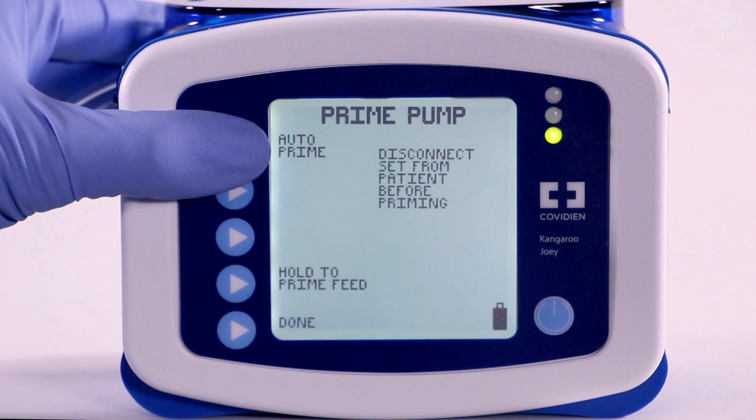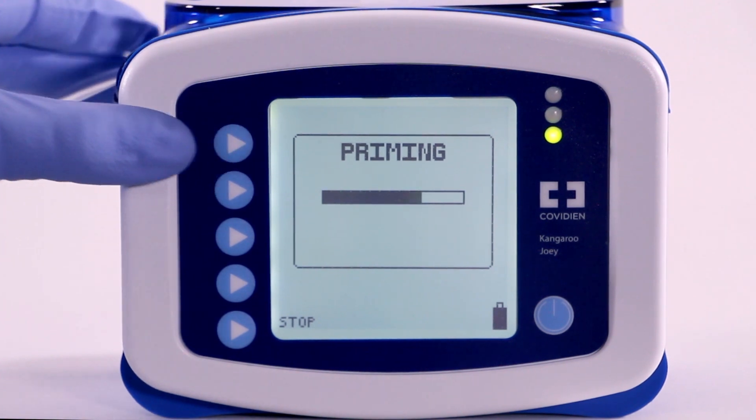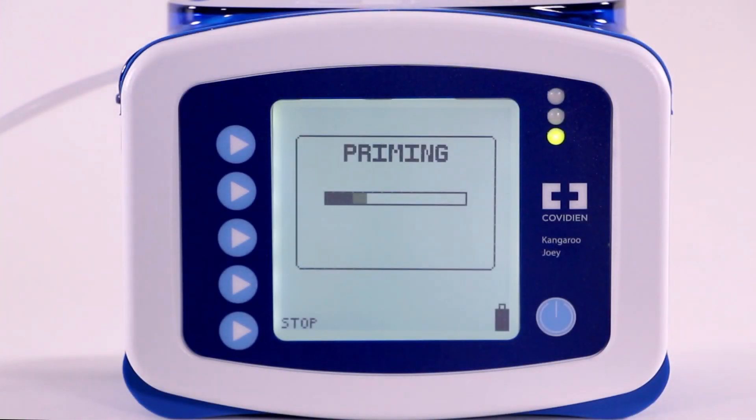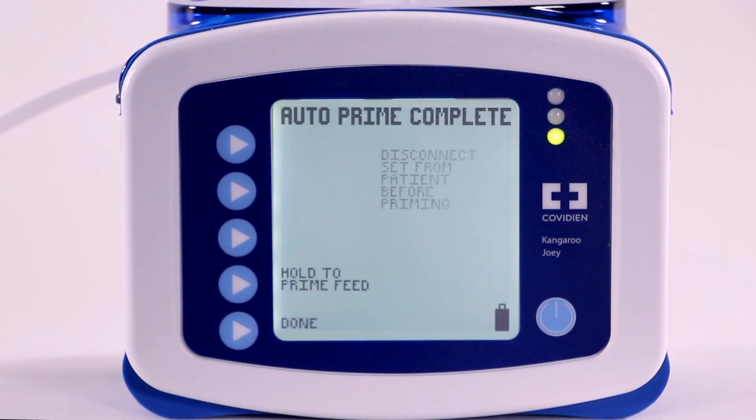You will most often use the AutoPrime option. When selected, the pump will automatically prime the feed line and will stop just before reaching the end of the line. When AutoPriming is completed, the status line will show AutoPrime Complete.